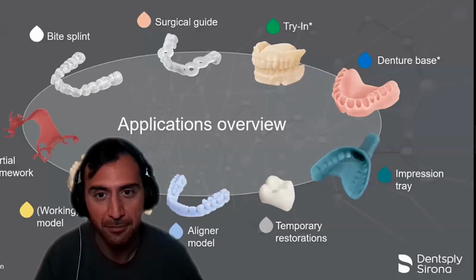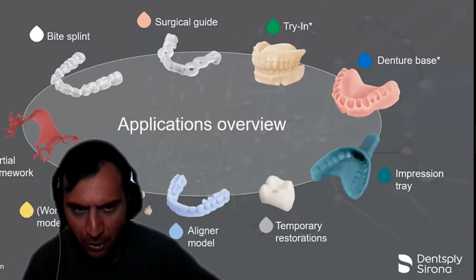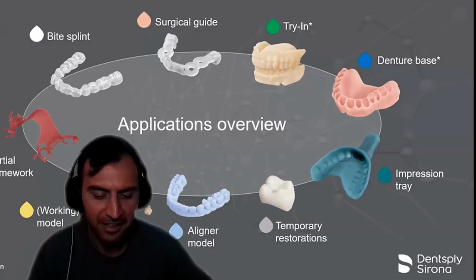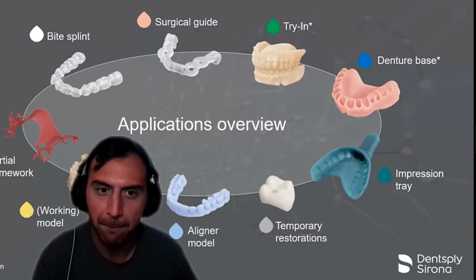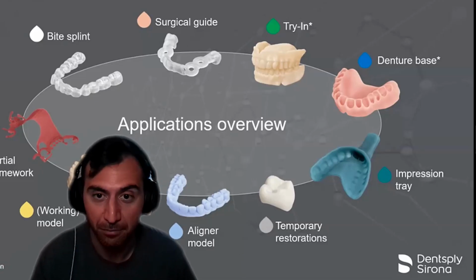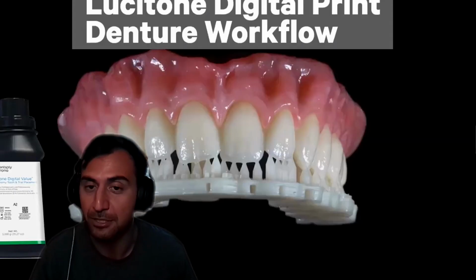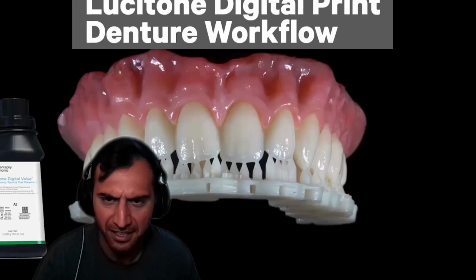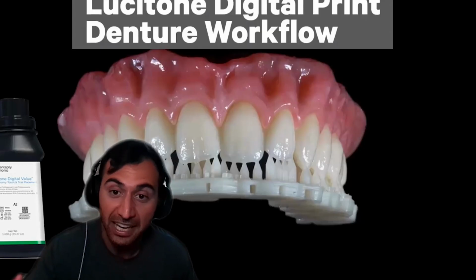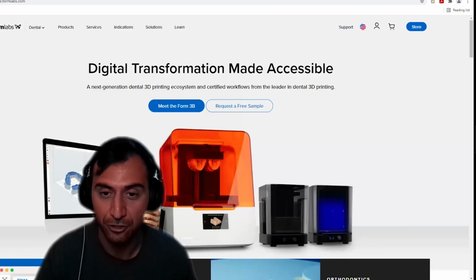Now, is everything FDA approved? No. But with the push toward printers designated for dentistry, some companies have made a push to get some materials FDA approved. And so that process is coming. So we're not as much in the wild, wild west as we used to be. We've been 3D printing dentures, but we're even getting better at developing FDA approved denture materials to 3D print that have better accuracy and strength.